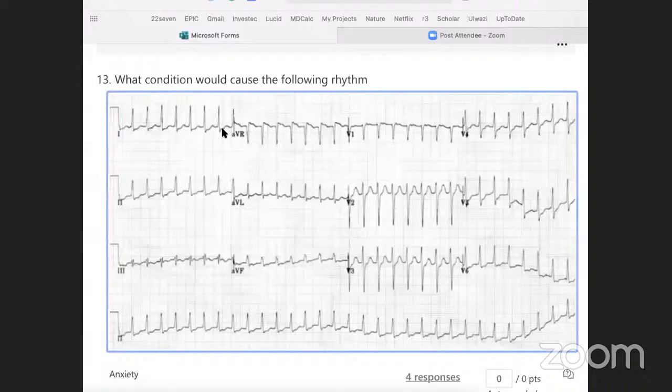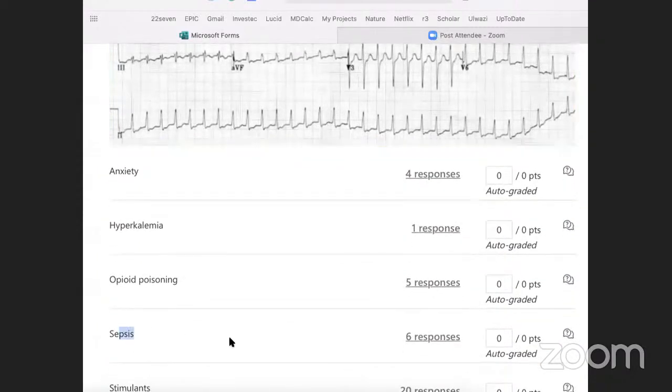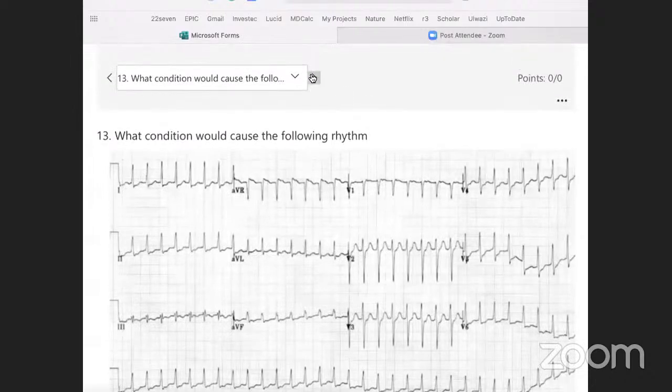It's just the sign of hypoxia, and during diastole the coronary arteries are not filling to reperfuse the heart. Generally this is classically what you find in a sepsis patient, as they have a tachycardia and hypoperfusion, and the widespread hypoperfusion would cause ST segment depression. But stimulants as well, as they would induce a tachycardia, is also a correct answer. The principle just being that the tachycardia is beating too fast to allow adequate perfusion of the heart, causing a diffuse ischemic pattern.